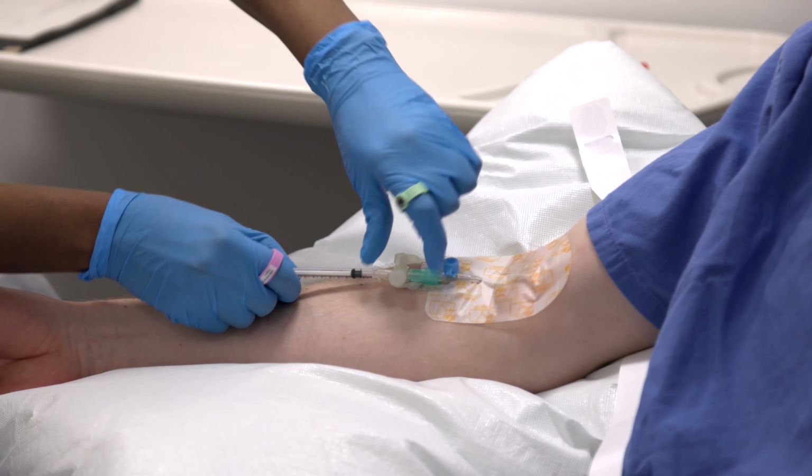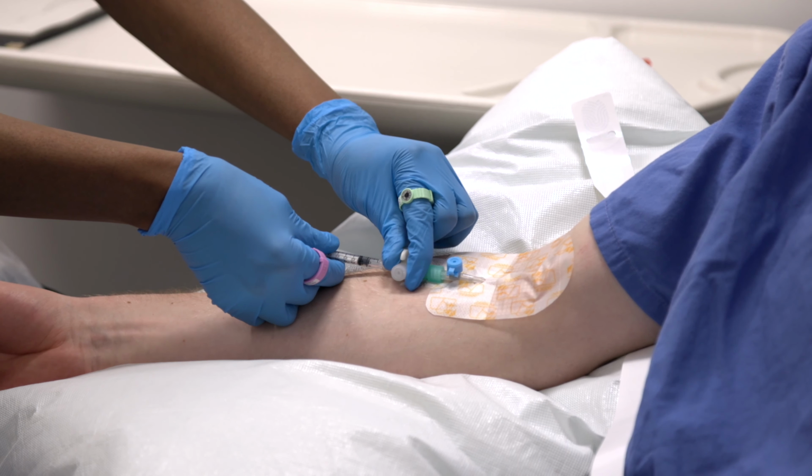You've hopefully already heard of the simple sugar glucose. Well, FDG will move around the body and be absorbed by the same things that glucose would be. But FDG is special because it has a radioactive atom of the element fluorine, and that's how we're able to make our pictures. How our radioactive sugar travels around the patient's body can tell us a lot about how it's working.